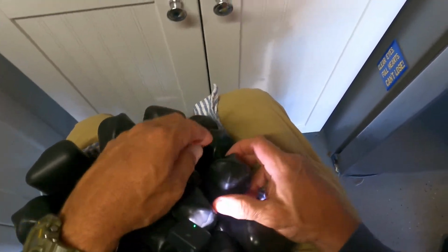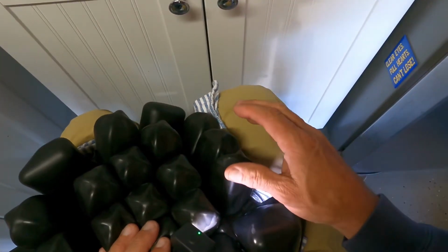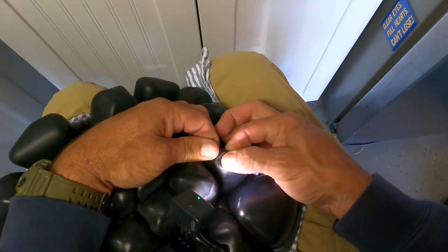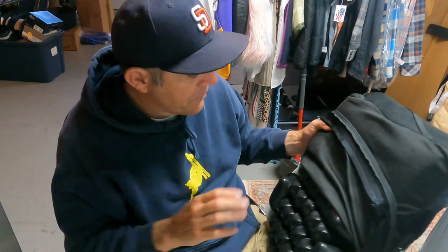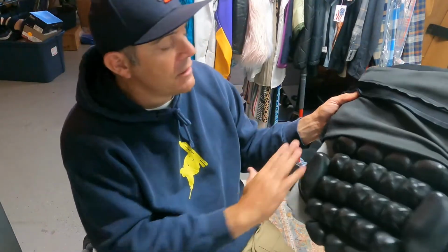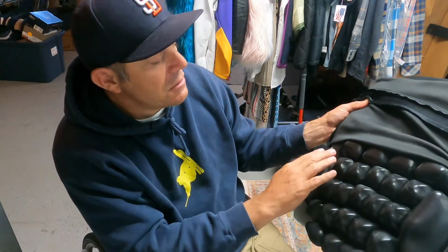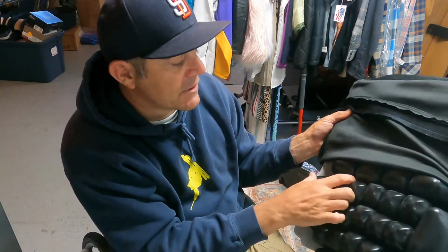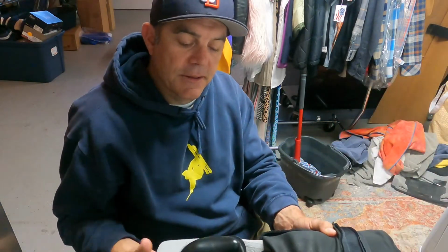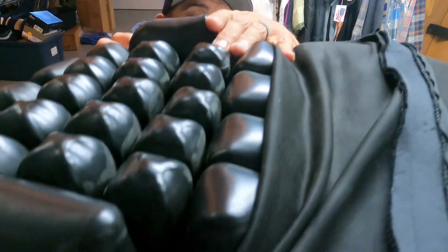Alright, so we should be all good to go, guys. A little square there, but that should be fine. All done. Got the patch on, got the cover on here. It was on the front left-hand side of the cushion, right on this second row of cells here, on this front left one right here. And you can kind of see where the patch is.